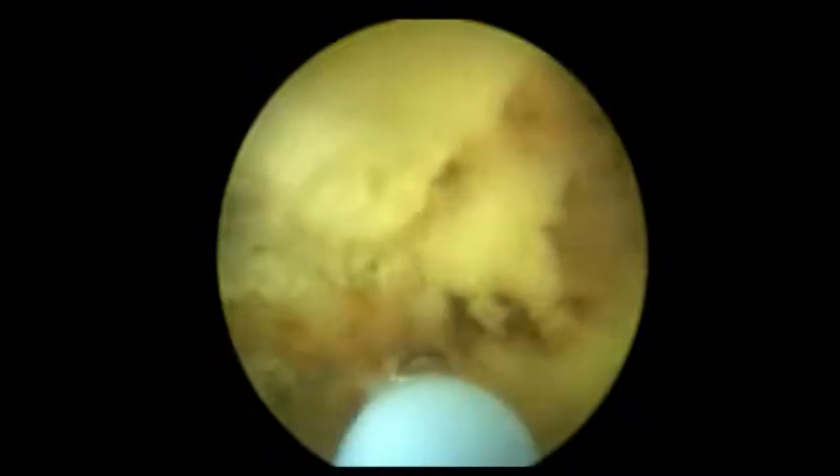Once you are in the surgical plane, use the scope to gently wedge underneath the median lobe and peel it up towards the bladder neck. You will need to stop lasering from time to time to bluntly peel the lobe up.